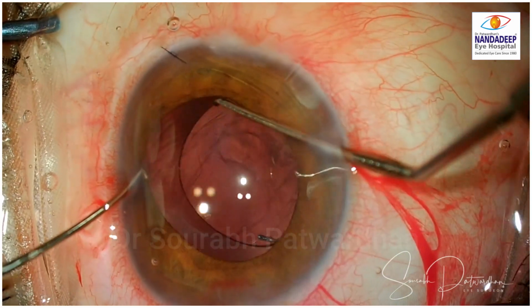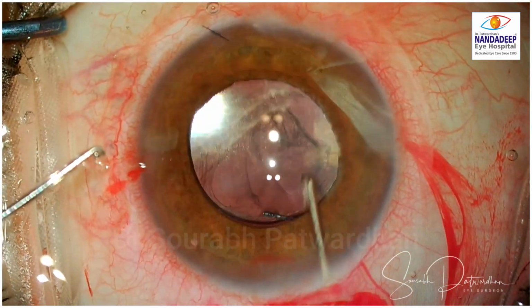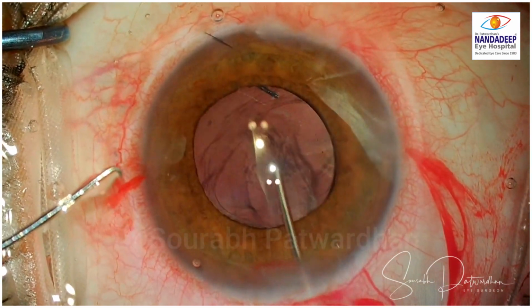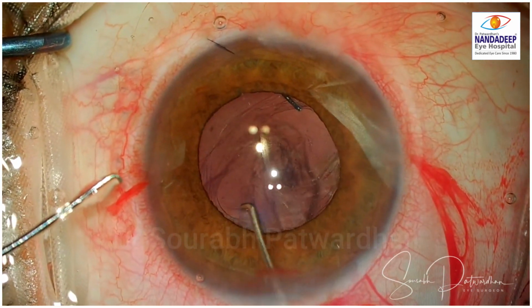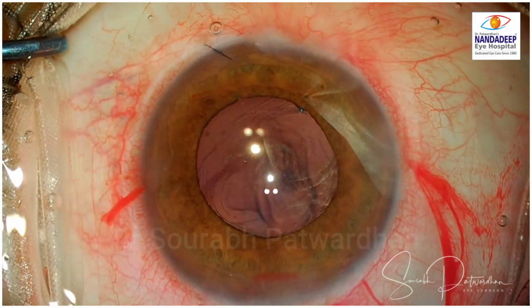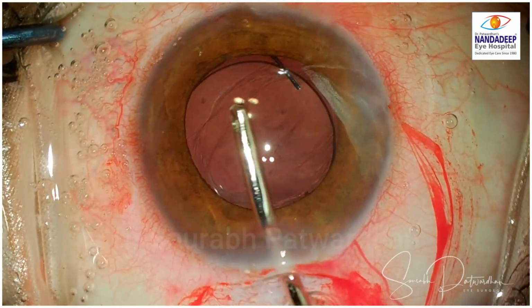So now both the haptics are in the sulcus. The anterior CCC margin is not small enough to do the optic capture, so I have to leave it in the sulcus itself without optic capture.